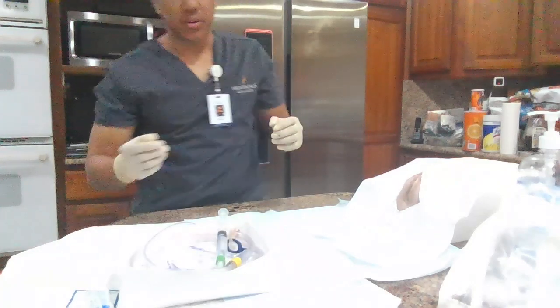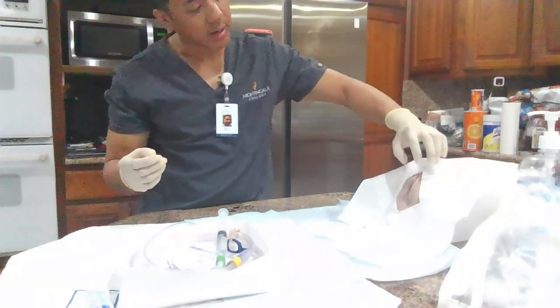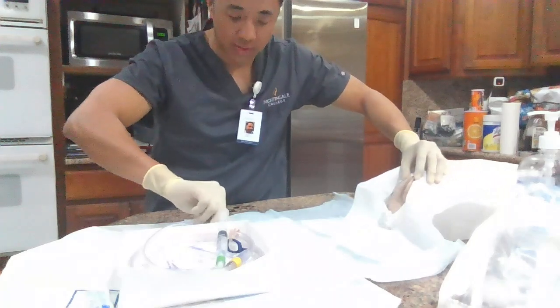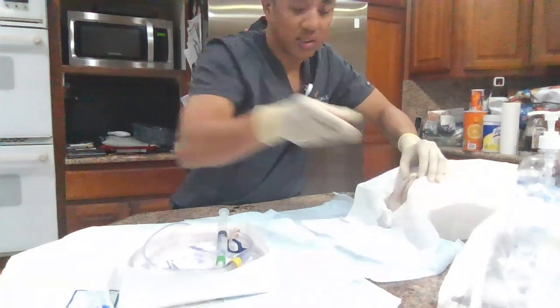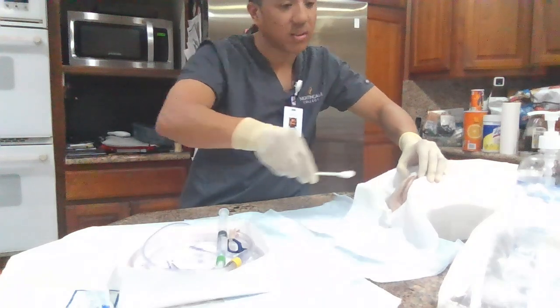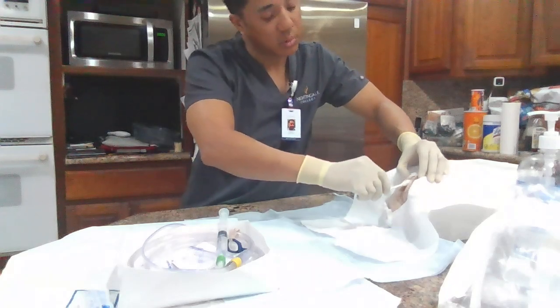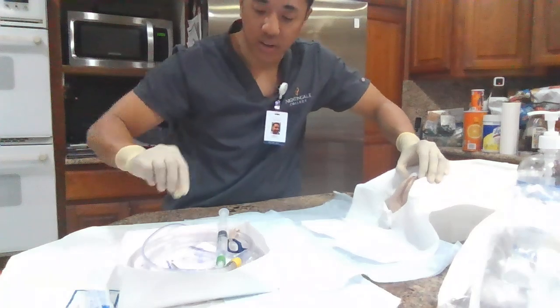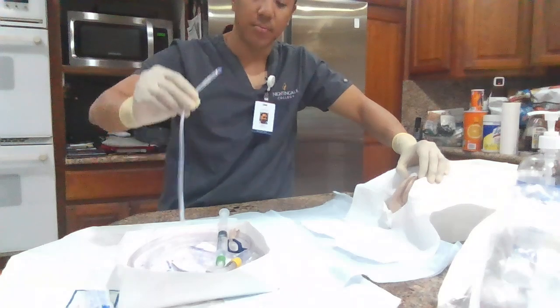All right, Mrs. Smith, you're going to feel my hands here while I clean you first. I'm going to use my non-dominant hand and place my hand here just like this, so I can open up the labia, okay? I'm going to take my first cotton tip and swab anterior to posterior, far side. I'm going to take my other tip and swab anterior to posterior, near side. And then I'm going to take my last cotton tip and swab anterior to posterior, medial. Okay, I am now going to grab my Foley catheter, grabbing 2 to 3 inches from the tip.